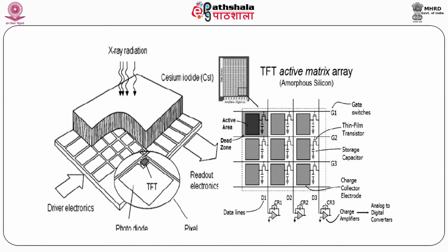Now, coming to the advantages of digital radiography. The advantage of digital radiography is that the digital images are flexible. It allows a variety of manipulations such as magnification, compression, edge enhancement, cropping, and inversion.